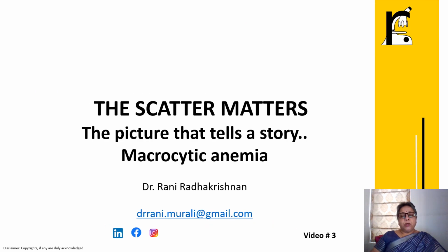So we come to another episode of The Scatter Matters, the picture that tells you a story. The picture that is given by the cell counter, which, if we learn how to interpret, will lead us to the diagnosis. It's not just the numbers, but we learn to look at the pictures. In this series, where I have started with an introduction, today we will be discussing the differential diagnosis of macrocytic anemias.